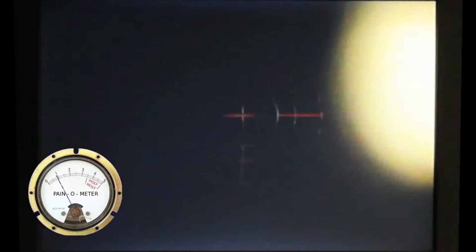But anyway, so let's look at that again. Let's look at my other eye. So they cut the tab right at the bottom, and then they go up and over. You can see the tab is not as deep there. And then they cut all the way across. I guess they're focusing the laser just below the surface of the cornea, I'm assuming. I'm not a doctor. And then when they get to the far edge, the laser does the whole perimeter and cuts it loose. Yeah, that's awesome. Really cool. Only thing cooler than that's a lightsaber.